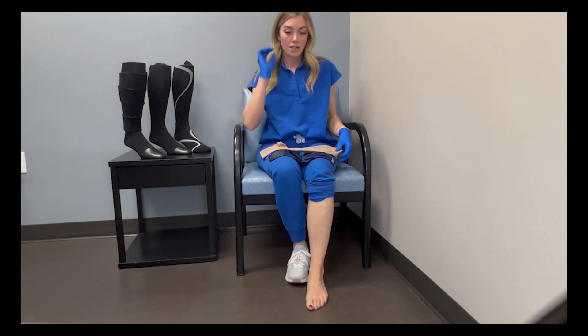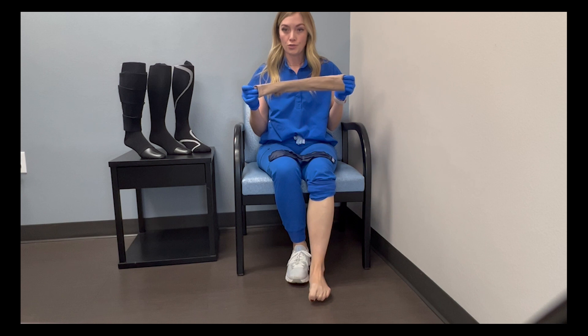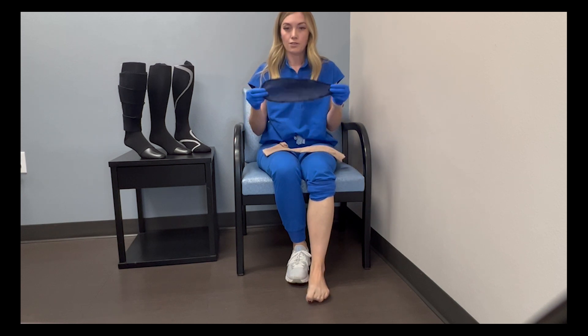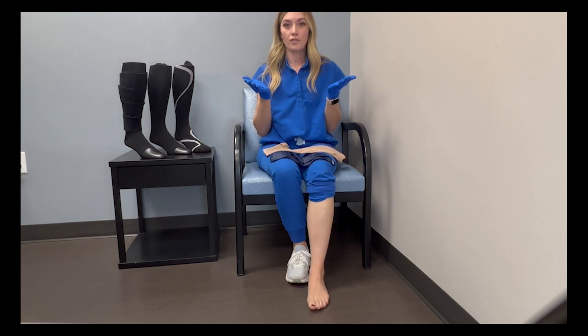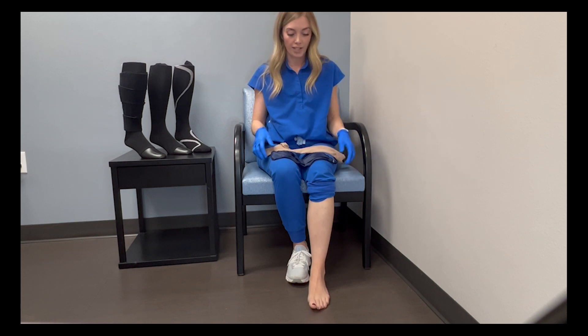We have a couple different options. The first one is for an open toe sock. You're going to need this little silk booty, or if you don't have this, a plastic thin trash bag will do as well, and then also a pair of gloves — either cleaning rubber gloves or gardening gloves — something with some texture to help get a hold of it.